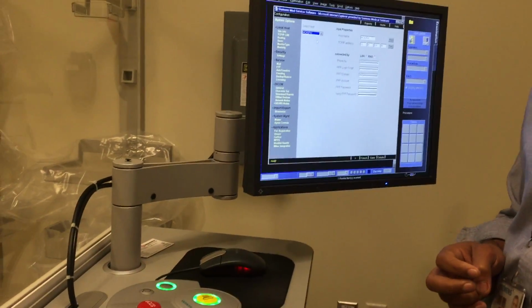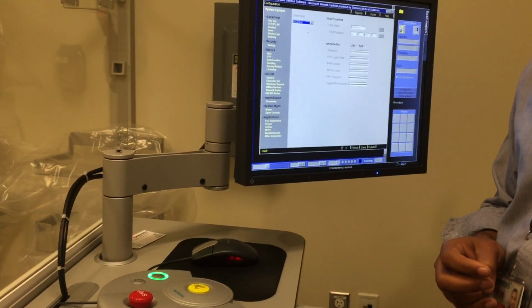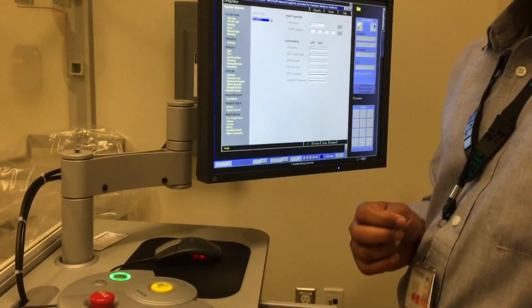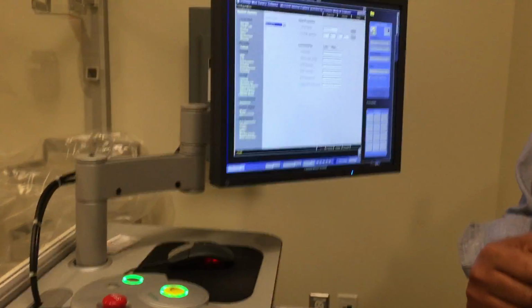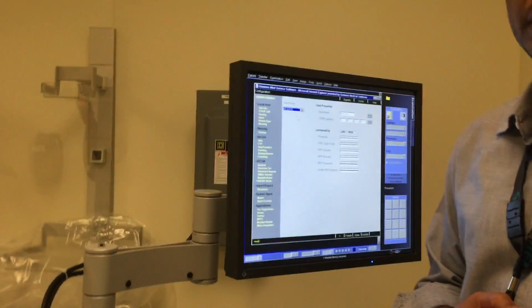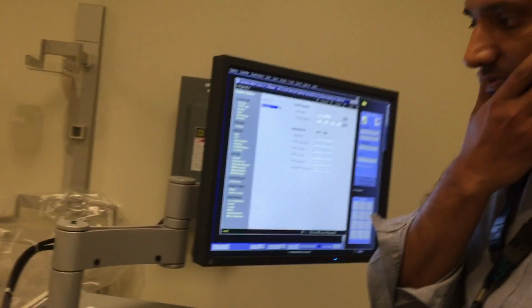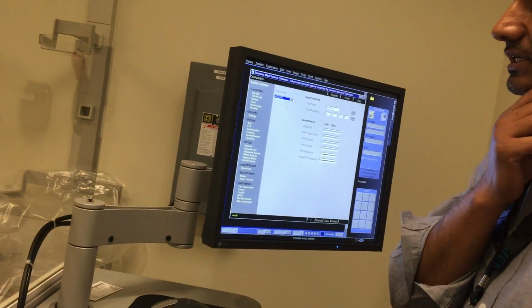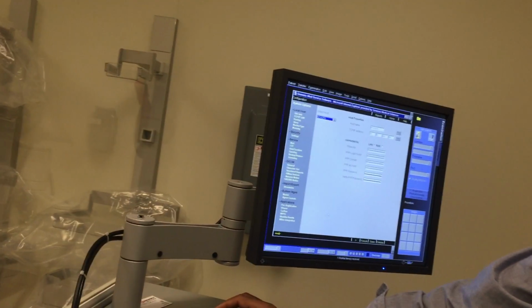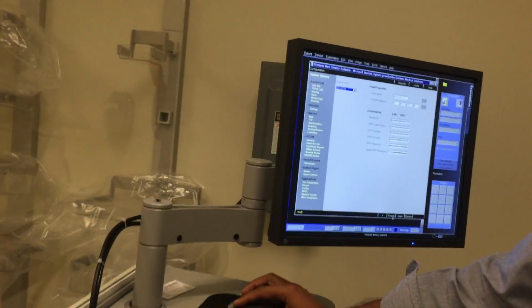The physician also prescribes the type of exam in this work list? That's right. At the front desk, they fill in all this information. What type of different exam views? That's right. What type of exam is required? Right. Let me go and show you quickly if we have a work list.